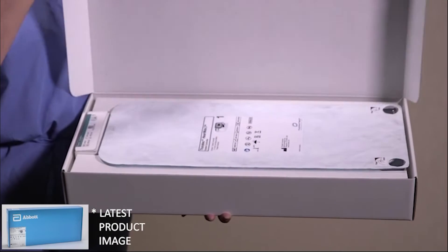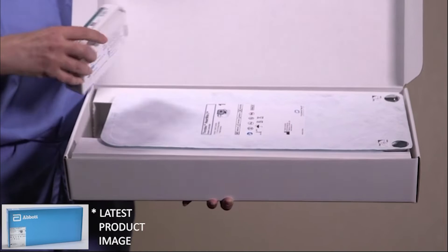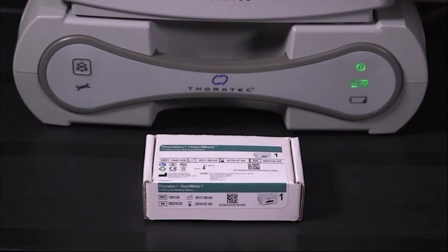To set up the system controller, first open the box and remove the box with the system controller backup battery and the backup battery installation components, and set it aside. The backup battery will be installed after device implant once the sterile field has been taken down.